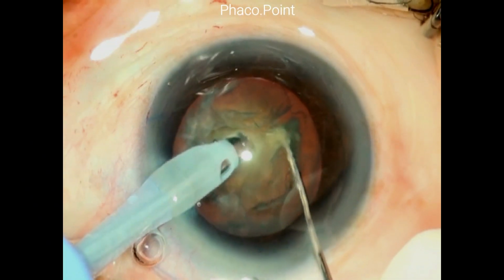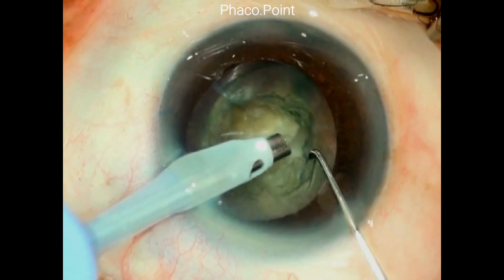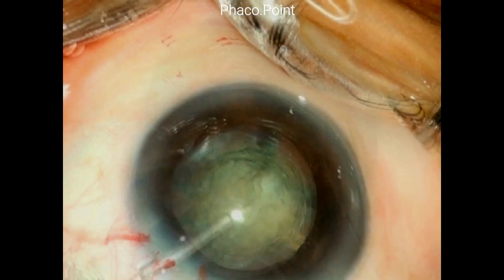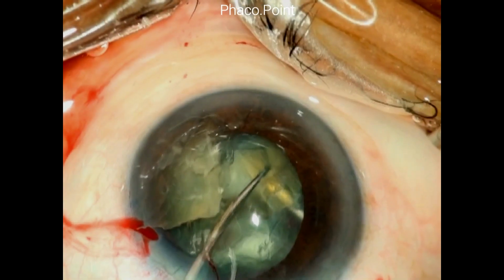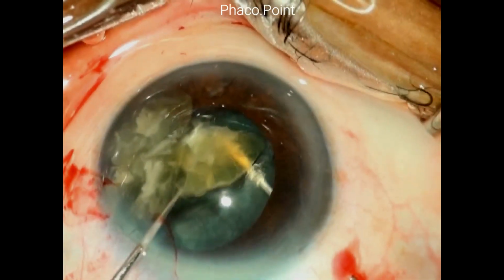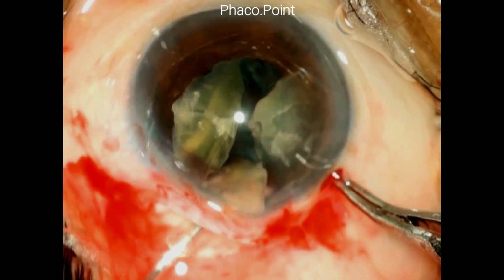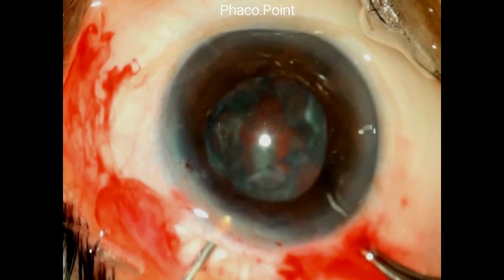Having noticed this occurrence, I then introduce a 26 number needle via the pars plana to prevent the fragments from falling down. The fragments are then brought up into the anterior chamber, after which they are removed from the eye turn by turn via a scleral tunnel which is then created, prior to performing a limited anterior vitrectomy.